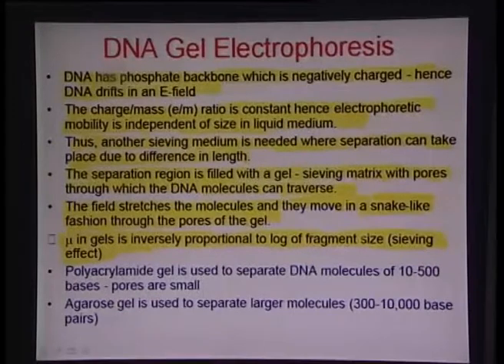That can be done by heating the medium using a microwave or some other mechanism for a long time, so that it melts the molecule and makes a viscous slurry out of this mixture. Once this is allowed to settle and cool, there is development of several nucleation centers, and there is a slow development of the gel phase which contains a lot of water as well as the solid media.